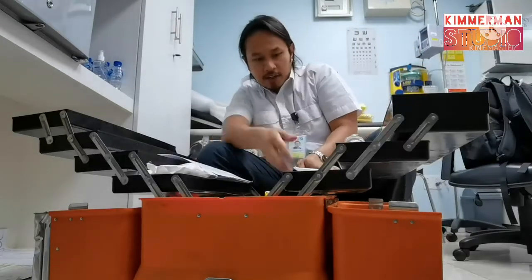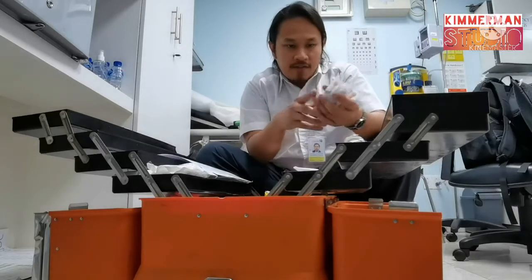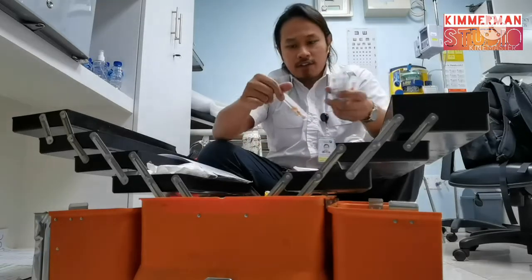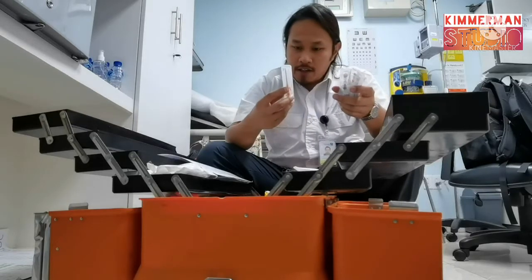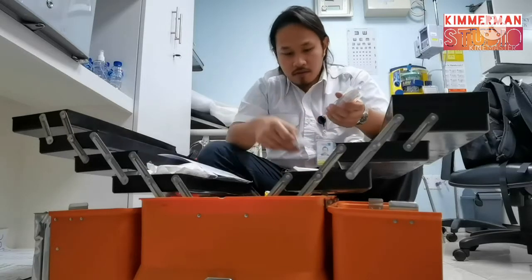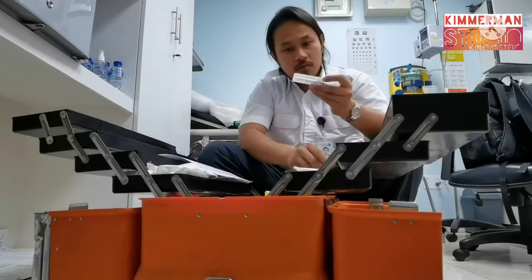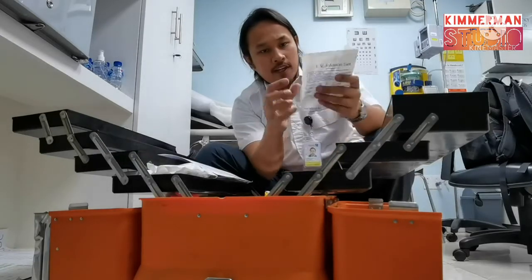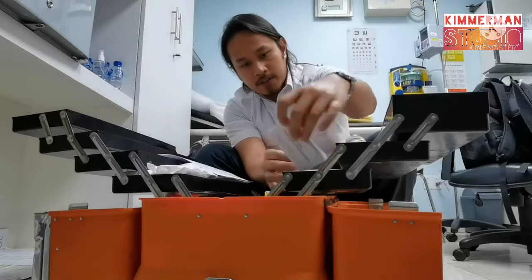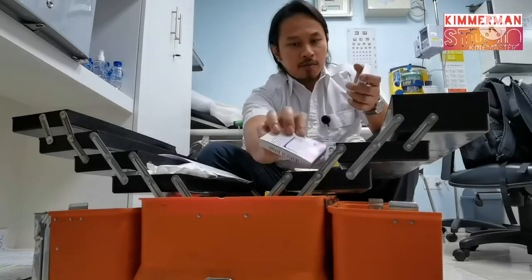So we go now to the third shelf. We also have here IV cannulas, the gray one, 16 gauge, and the orange one, this is 14 gauge. Okay, check for the expiry date. Okay, we have an infusion set here. Expired. And triangular bandages, two triangular bandages. As I said, this is for two victims. Okay, that is expired.